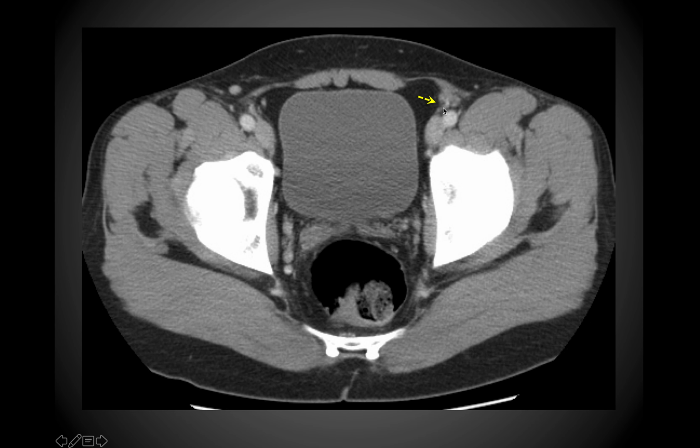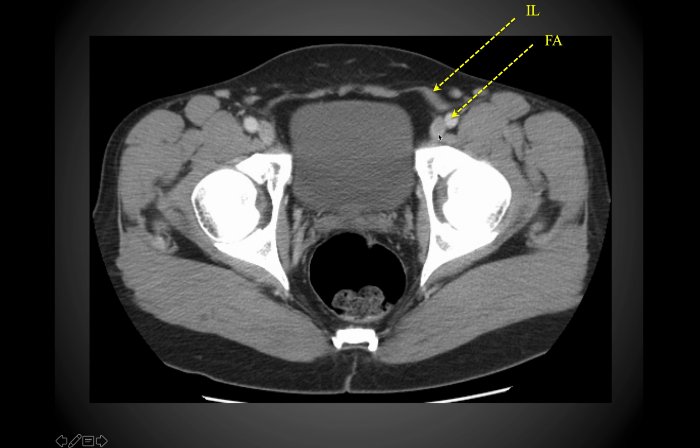And then now at this level, so I'm just going to go back up to this region right here, where again you can see the inferior epigastrics attaching to the external iliacs. And then at this point now we can see the femoral vessels, so the femoral artery and vein, and then the inguinal ligament cutting across right here.